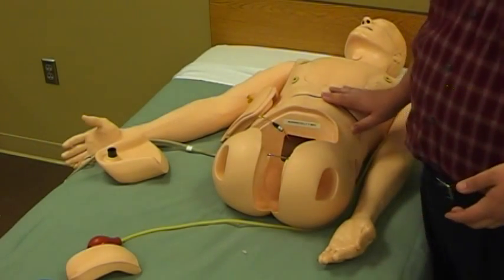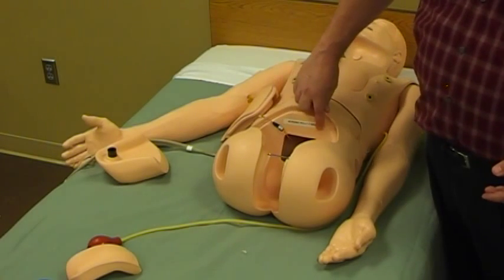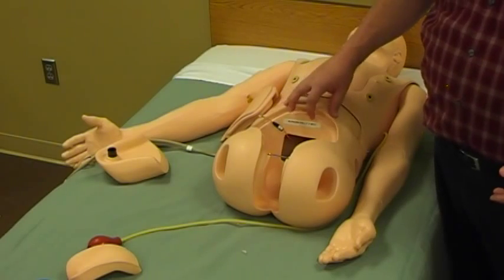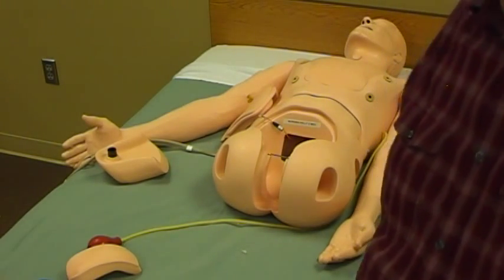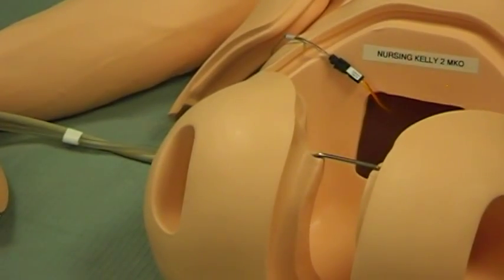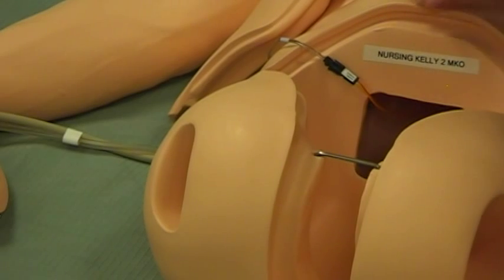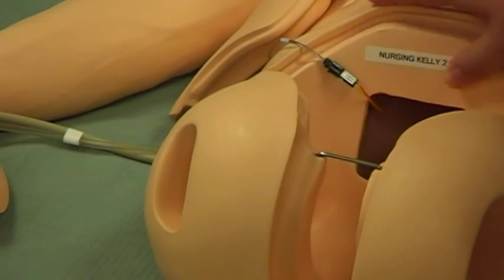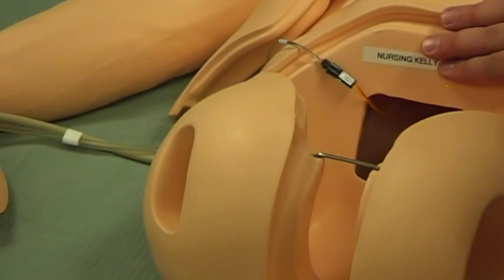This one here is Nursing Kelly. What I've done is used a standard label maker found on every one of our campuses and made a label that says 'Nursing Kelly 2 MKO.' I've placed that inside the abdominal cavity. I also placed identifying stickers on the backs of some mannequins, but those tend to get rubbed off over time. This one inside hasn't come off yet — it's a nicely protected spot.